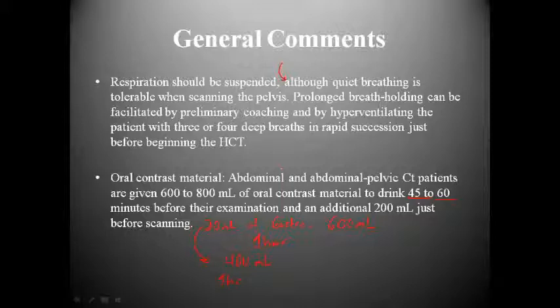So it's essential to get it to the rectum. So you always want the contrast to be in the rectum, the oral contrast. Very, very important here.